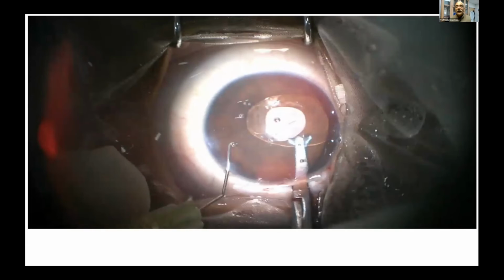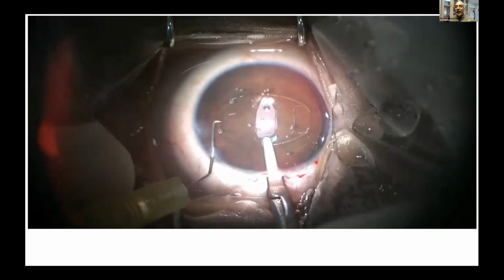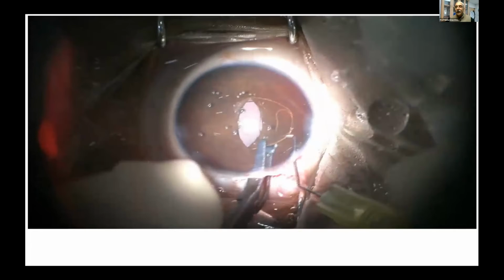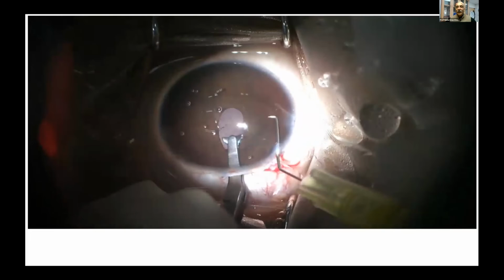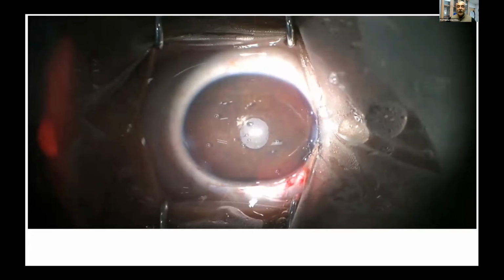There's no point in putting fixated lenses in the globes, which are already stretching and becoming pinned out in the periphery, because it won't sustain well. You see how well you can see the impression of the claw through the iris, and you're able to put it and just tuck it, and that's about it. And put a suture. Make sure you put 2 sutures because it's a 5.2 incision.